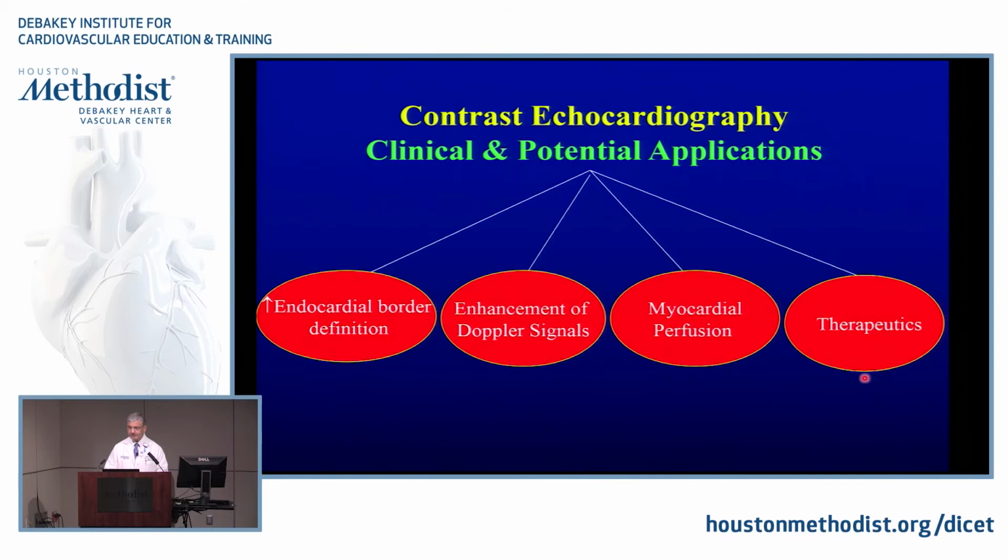If you want the truth, we could stop right here, because the major message is to know that your ultrasound machine settings interfere with your imaging. Two, you need to know the mechanical index and harmonic settings you're dealing with. If you have too much destruction, you may want to lower your mechanical index so you don't have as much destruction. So let's go through a few things to solidify what we're talking about.